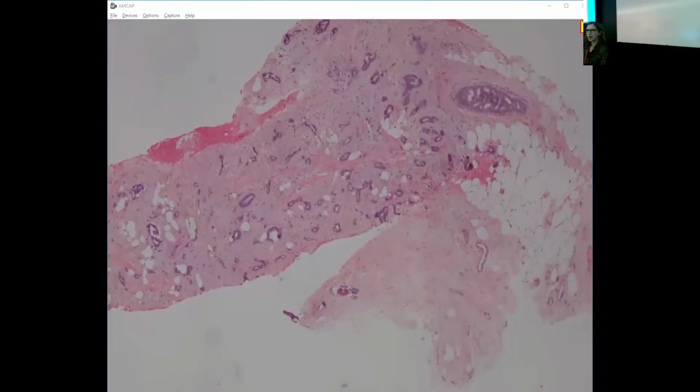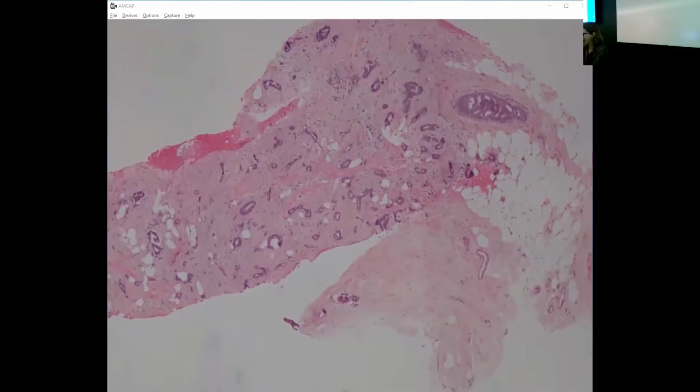All right, so now I am scheduled to do a case presentation. So I thought I would show some lesions related to what we just talked about. I think they're mostly straightforward examples of what we're talking about. So hopefully you can just relax and enjoy.